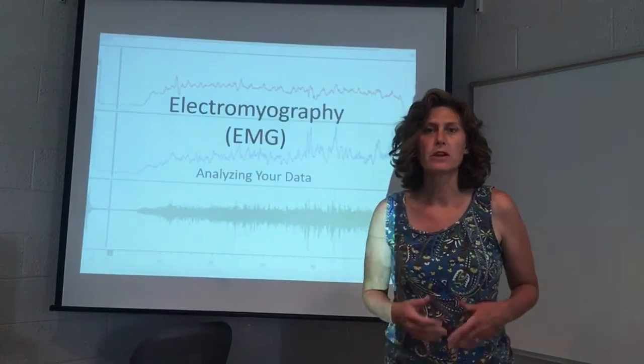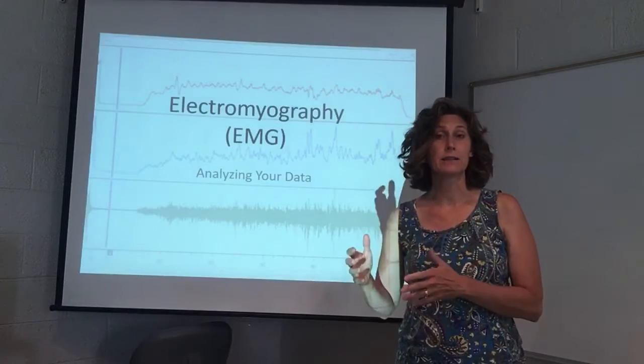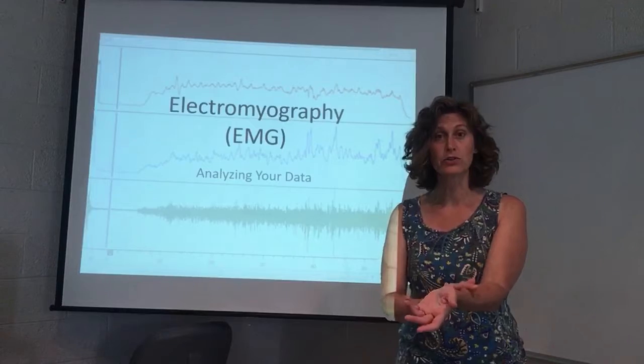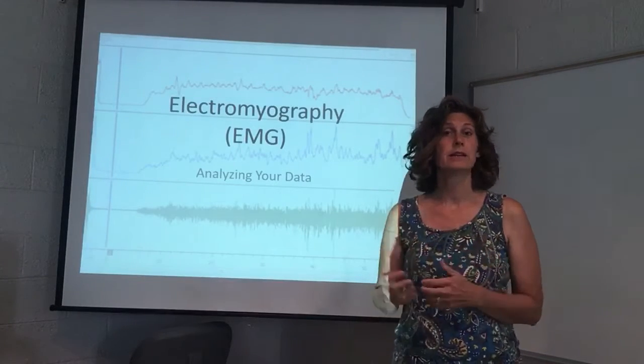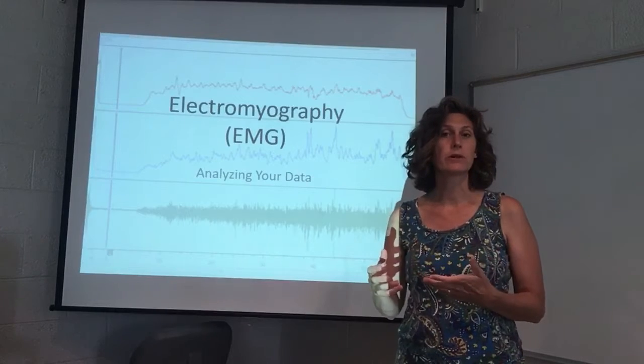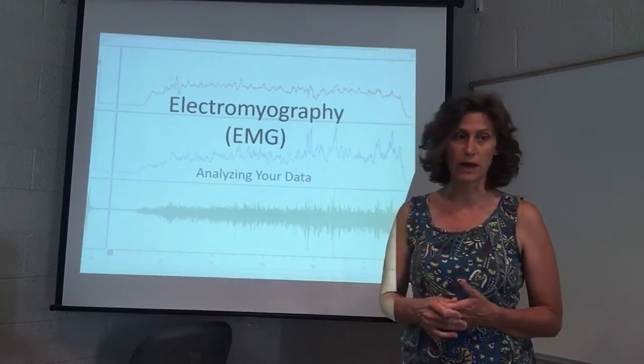Okay, this brief video is going to introduce to you how to do your data analysis. This comes in after you've run the procedure on yourself and gathered your data. The next step is to analyze the data and prepare it for the lab report and insert the data that's asked for in the lab report.